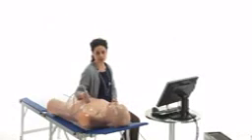Now we're going to summarize the different views where we can image the right ventricle, this time on the simulator. It's extremely essential to look at right ventricular function and size.